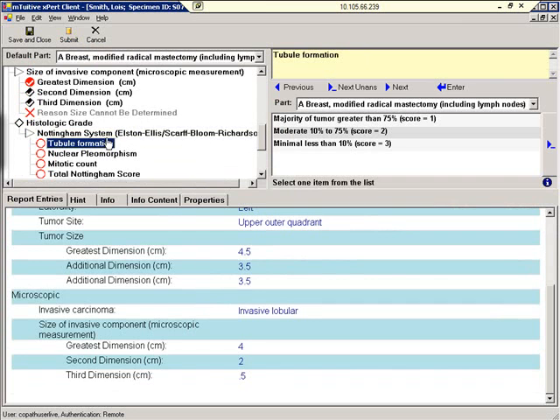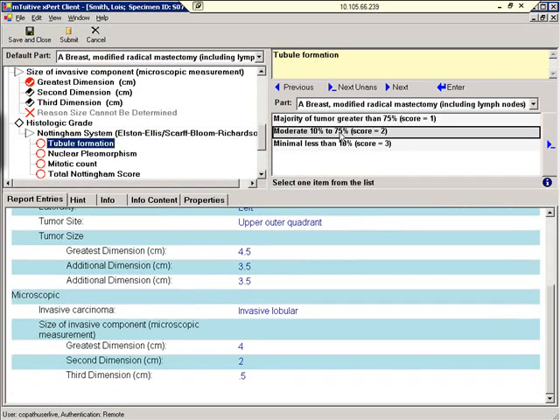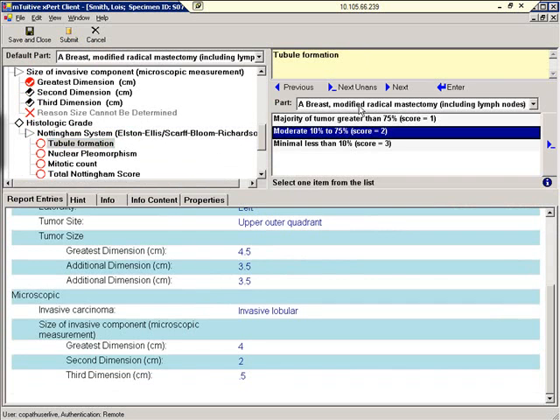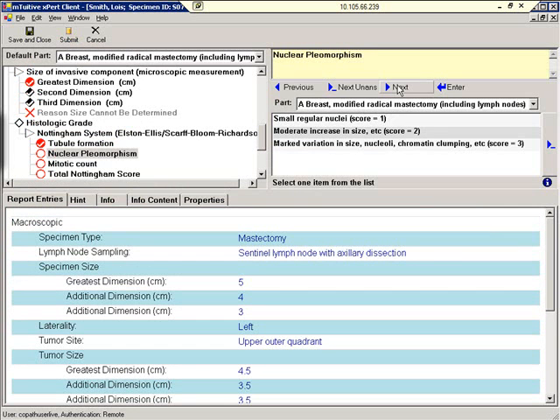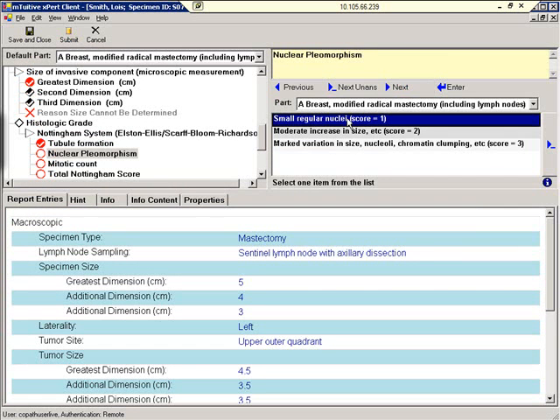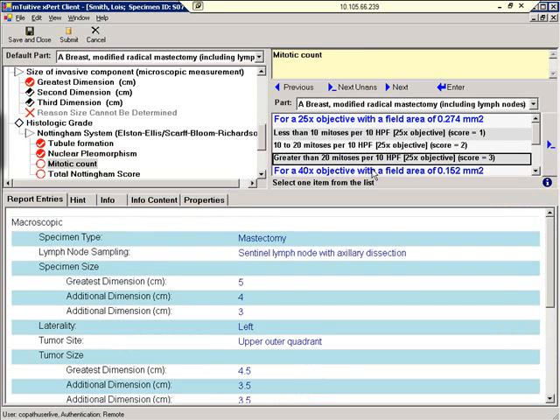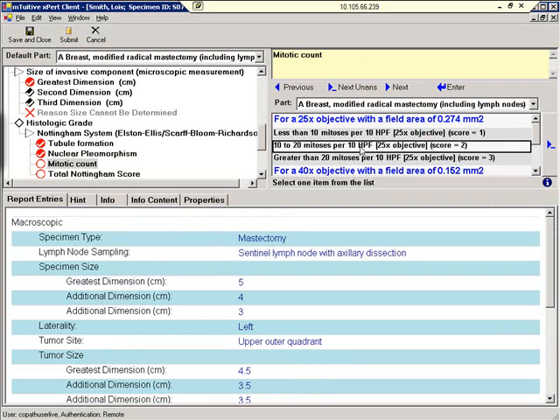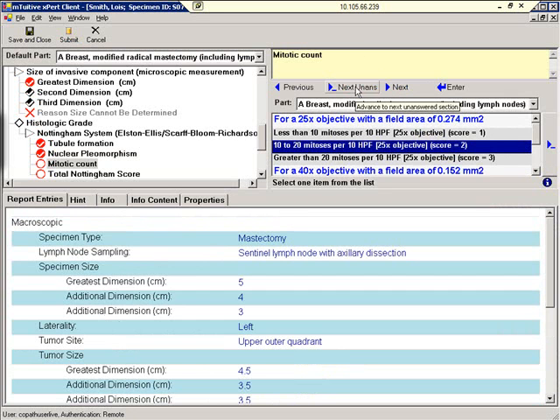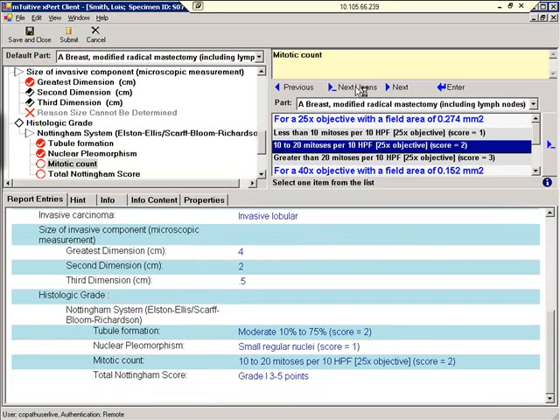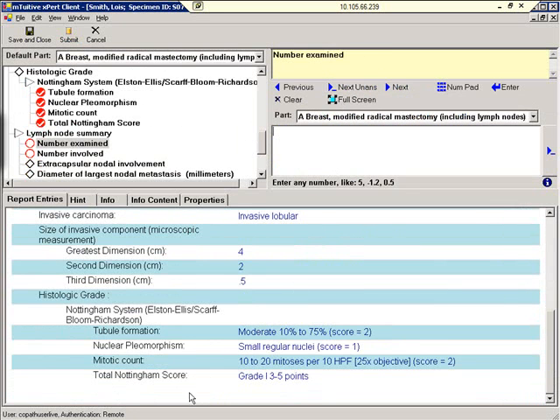The Nottingham system. Tubule formation. We'll select moderate. Nuclear pleomorphism. Small. Mitotic count. 10 to 20. Now we'll click Next unanswered. And as you can see, the total Nottingham score has been calculated for the end user.